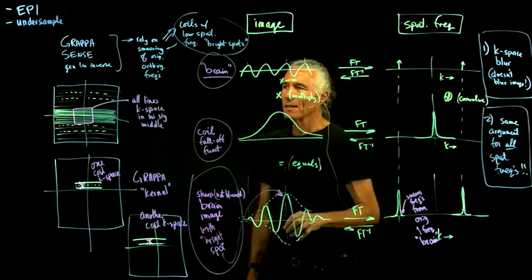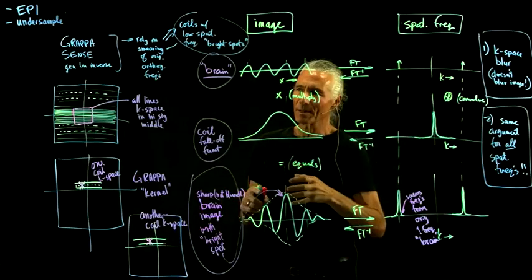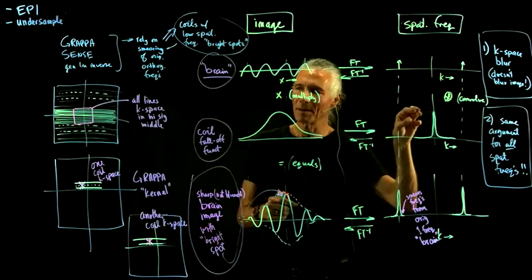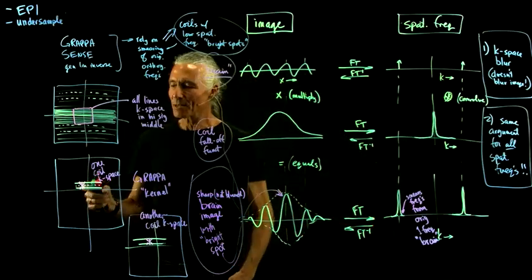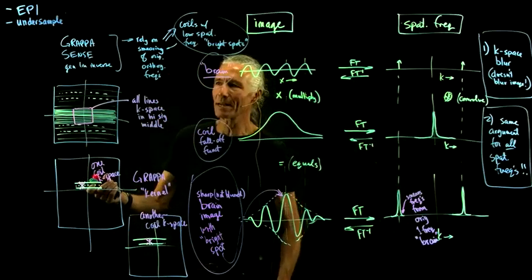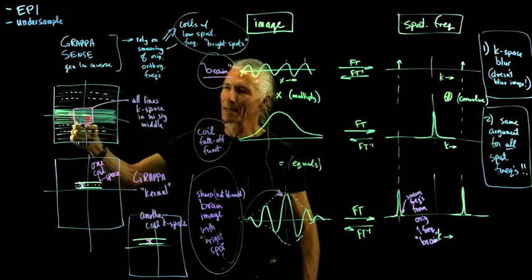And so when you're recording with a coil with a smooth fall-off function, instead of recording a point in K-space, it's almost like you're recording a little smear in K-space that's going across K-space. Because of that, we can intelligently reconstruct missing data points. This is a big speed up because we only collected half of the data. We essentially skipped every other line of K-space and then filled it in, using our first scan where we collected every line of K-space.